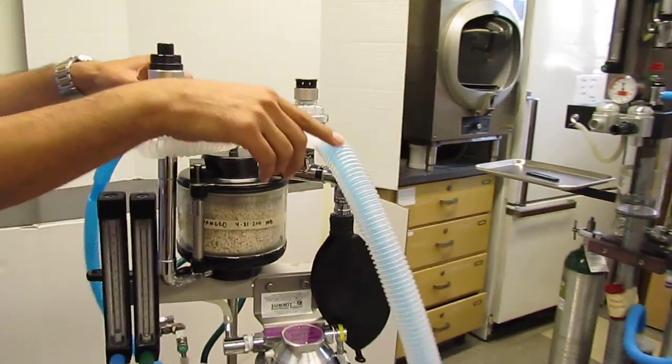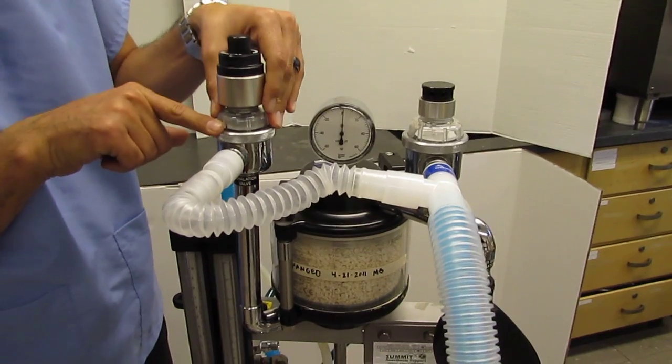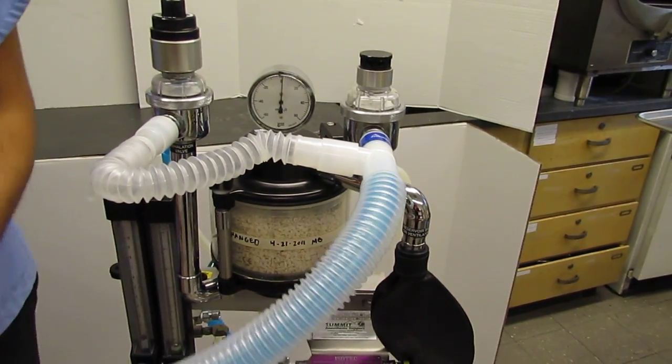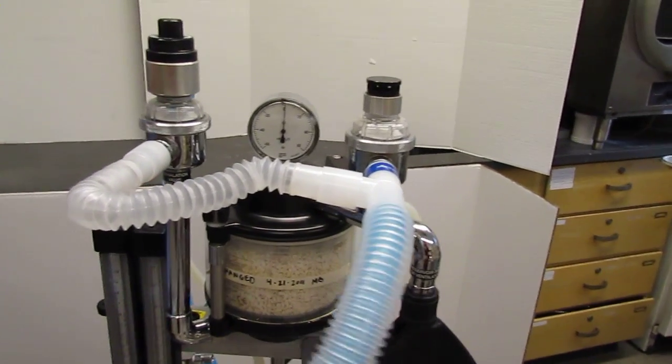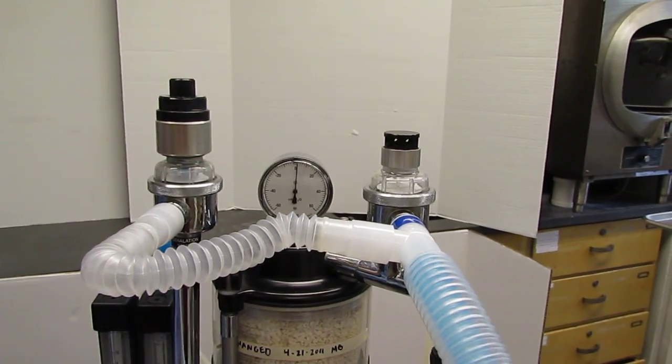As we get to this point here and we exhaled, we redirect the exhaled air to the expiratory unidirectional valve. This is a one-way valve that only flutters on exhalation, as I will demonstrate by exhaling into the circuit, and you see the valve flutters.